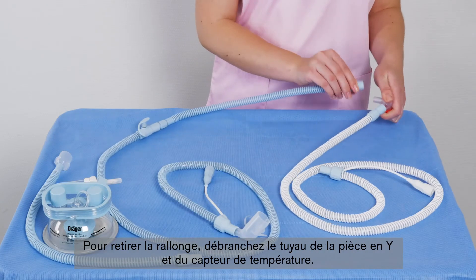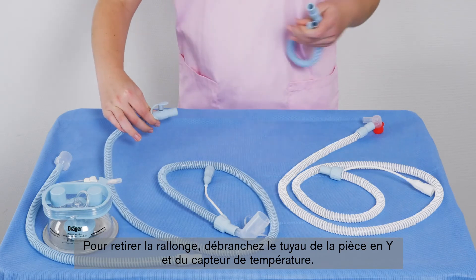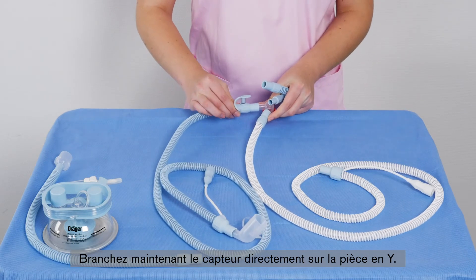To remove the extension from the system, disconnect the hose from the Y-piece and the temperature sensor. Now connect the sensor directly to the Y-piece.